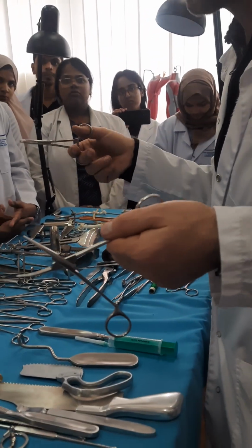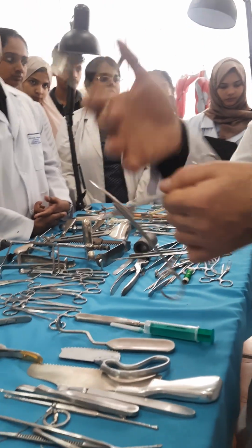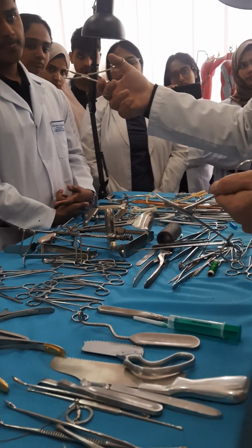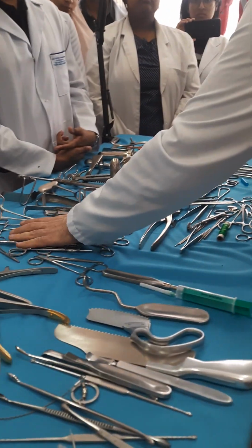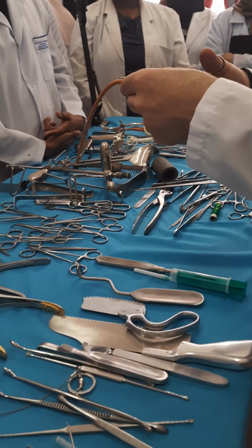Pean is used usually for capillary bleeding, where not so big gripping is necessary. Of course, grooves, of course, teeth, it is for gripping. This one will make more gripping, this one will make less gripping, but at the same time, it is more traumatic. That's why if you use Kocher forceps, you apply it strongly in that way, not this way.